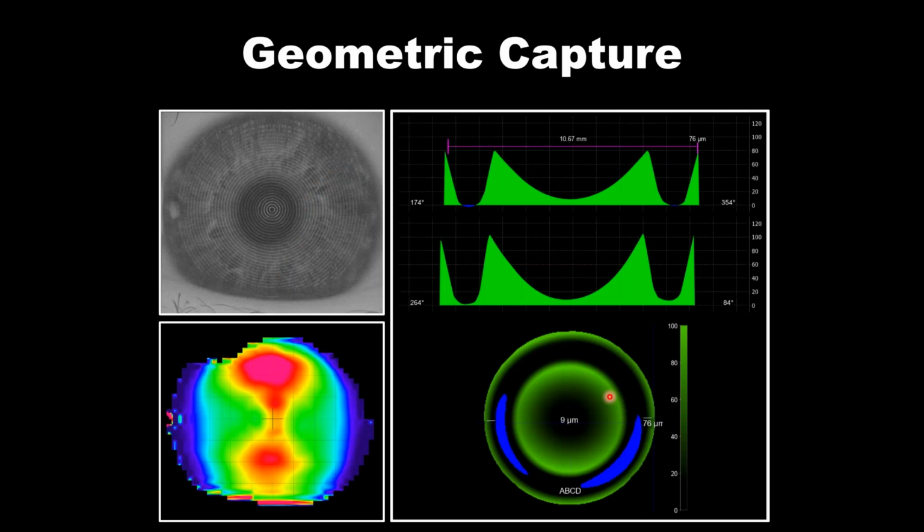Now, when we build a lens from this map, you're noticing the more balanced landing at 3 and 9 o'clock. And that's a dead giveaway right away that when we're fitting the regular cornea and we've placed the lens on in this 3D environment, we have the appropriate landing of the contact lens, that the software isn't struggling with weird height elevations in the eye surface.